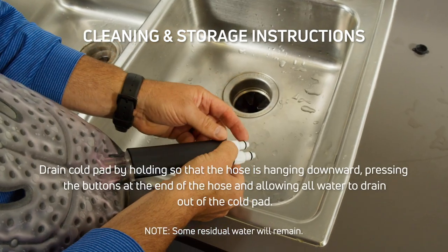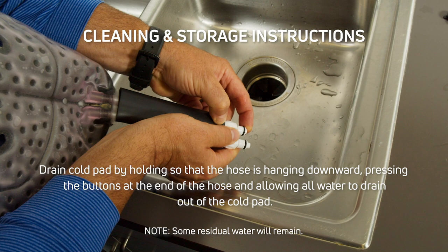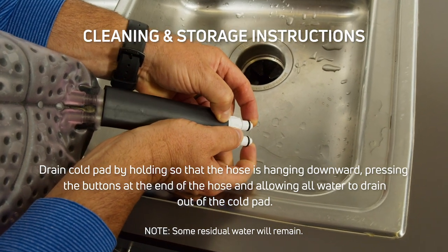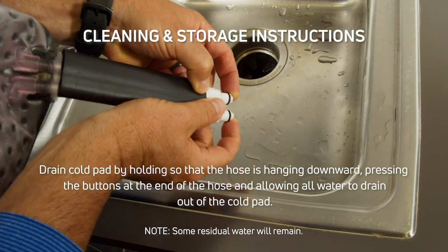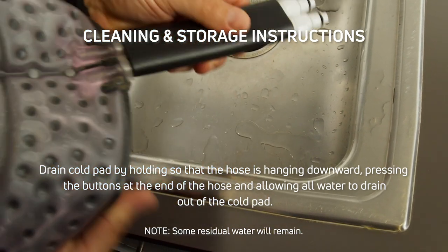Drain the cold pad by holding it so that the hose is hanging downward, pressing the buttons at the end of the hose and allowing all water to drain out of the cold pad. It is common and expected that some residual water will remain inside the cold pad.